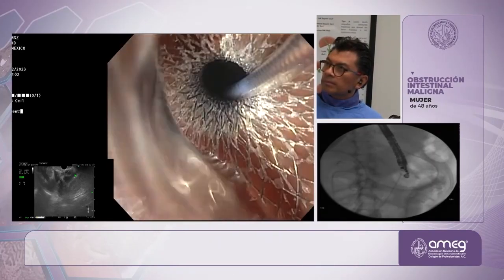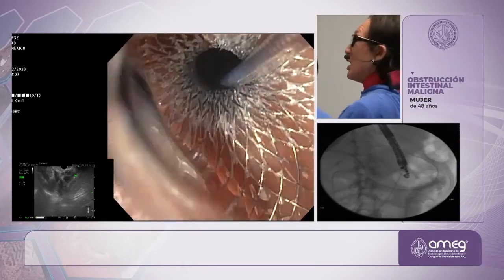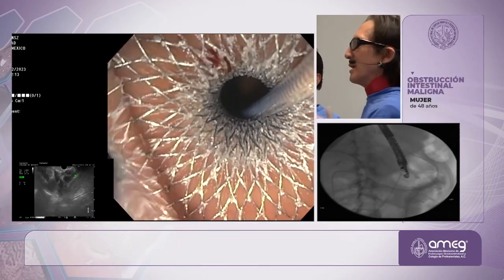Now, here's the fluid. Did you mix it with methylene blue? No. Oh, okay. Must without. You had me scared there because I was thinking, where's the methylene blue? Because I did ask to mix with the methylene blue, but it wasn't done.